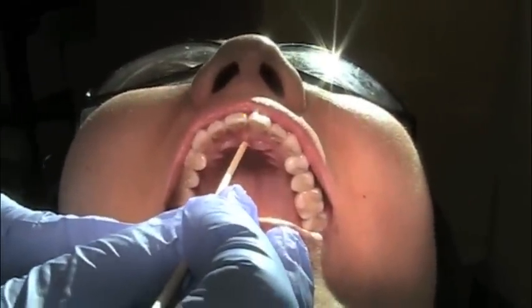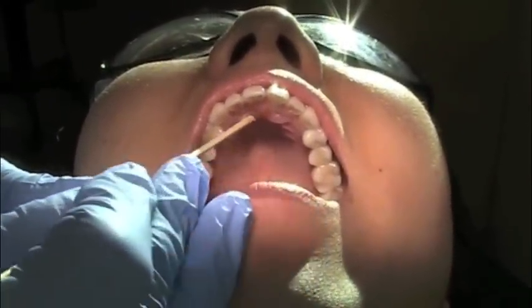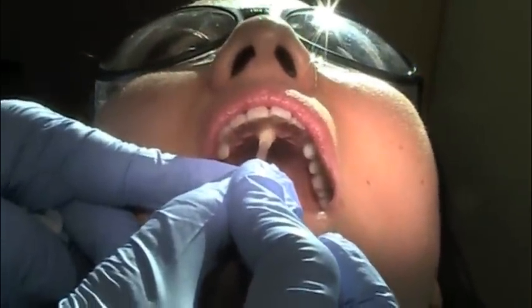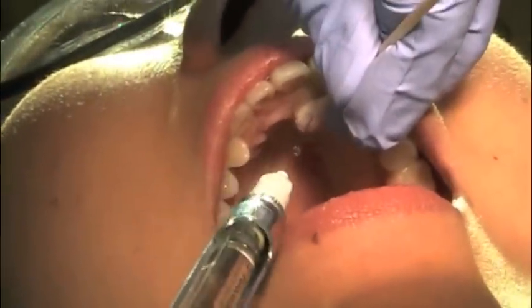Identify the palatine suture and incisive papilla. Select one side of the incisive papilla. Apply topical at the insertion site. Apply pressure anesthesia over the insertion site.